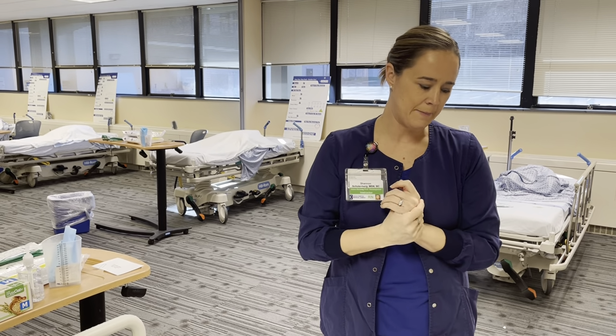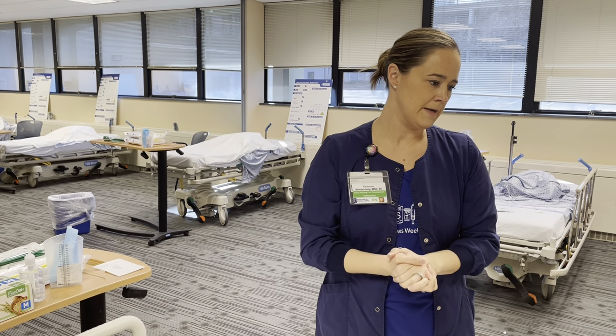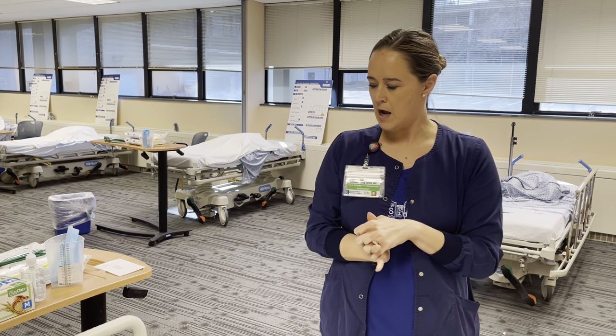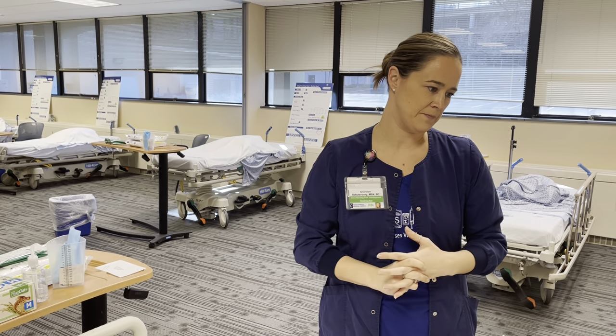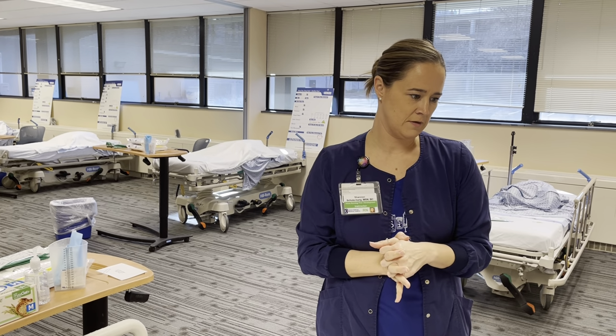Nope. Okay, good. I'm going to ask you a few questions. Do you have any allergies to latex? How do I know? Have you ever had a reaction to blowing up a balloon or using a condom? Nope. Okay, good. Do you have any allergies to iodine? How do I know? Do you have any problems eating shellfish? Nope. Excellent. And how about adhesive? No, I'm good on that.